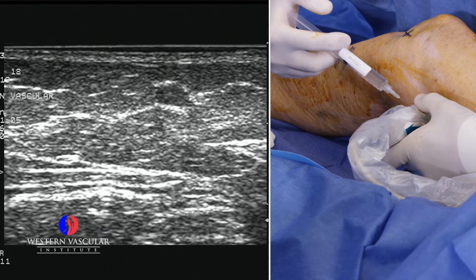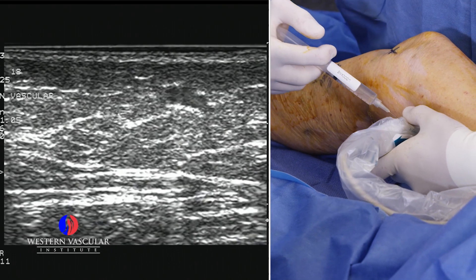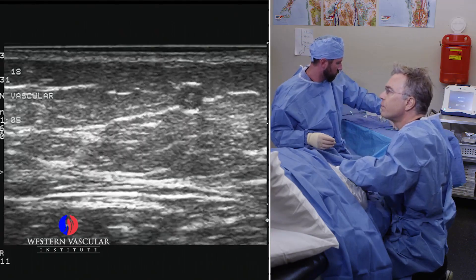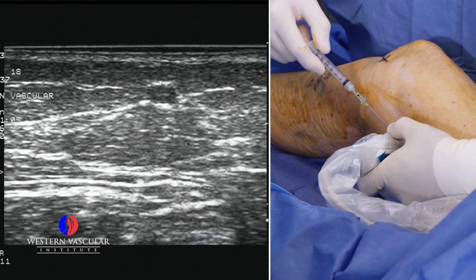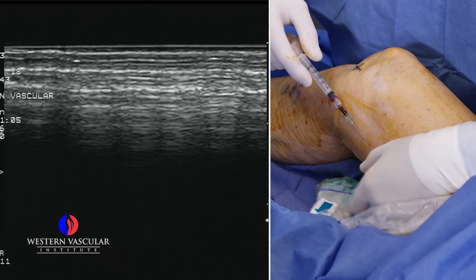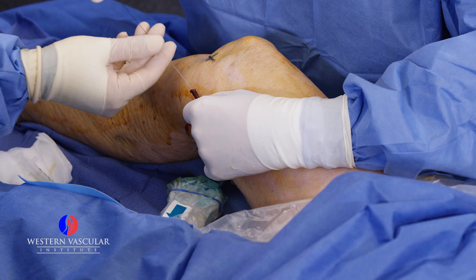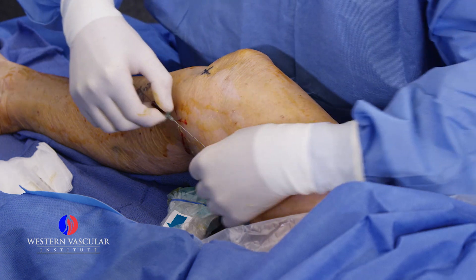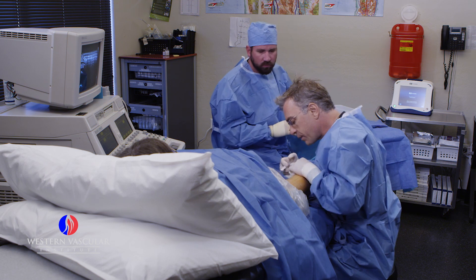We're going to locally numb up the skin here with some novocaine and give that a moment. Then we'll use an access needle to gain entry into the vein, which we've done. We're going to thread a tiny wire in — it's important not to move that needle or pop it out of the vein. We'll give her a little more local anesthesia so she doesn't feel any discomfort at the entry site.